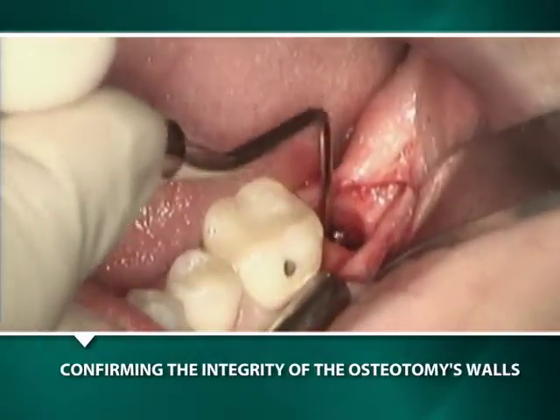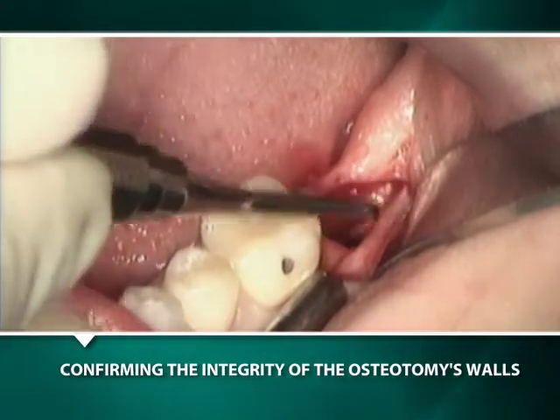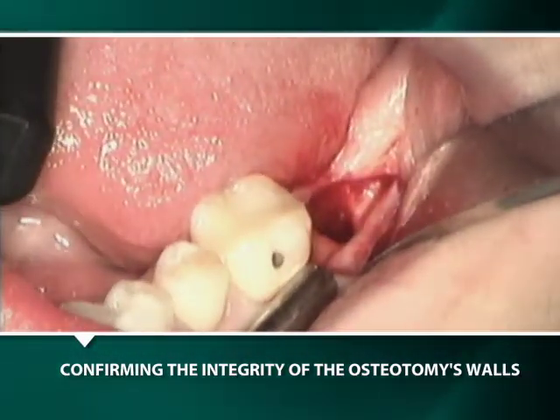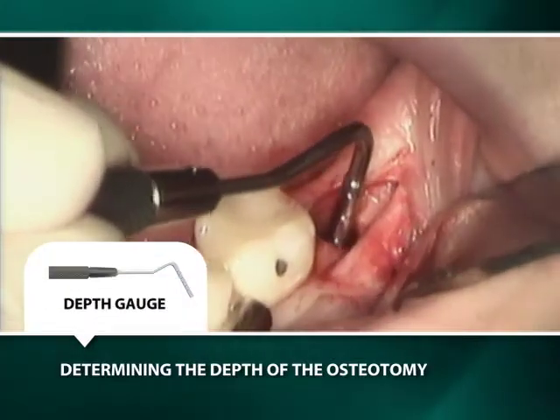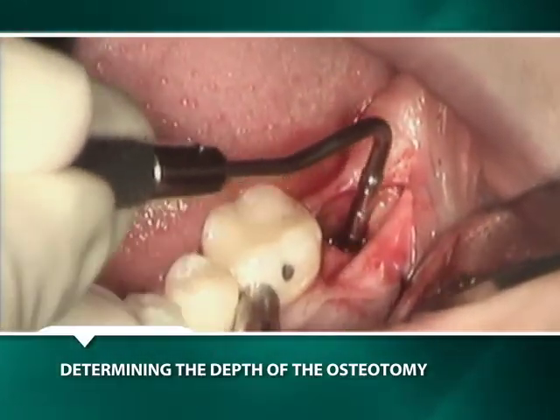A curette is used to remove any bone chips from the osteotomy and to evaluate its floor and four walls. The removal of any bone debris is critical to assure the utilization of the full depth of the osteotomy. The depth gauge is used to confirm the final depth of the osteotomy prior to the insertion of the implant.